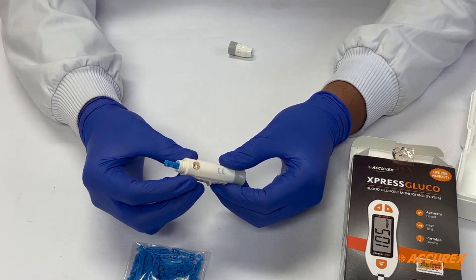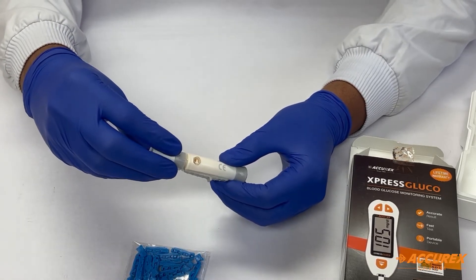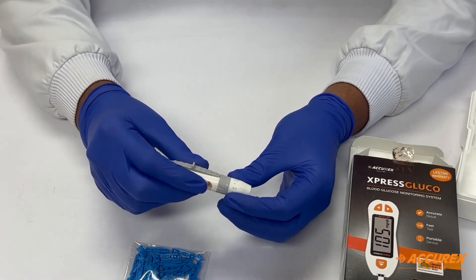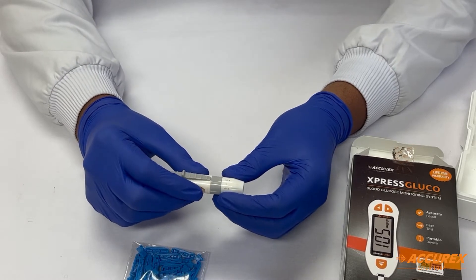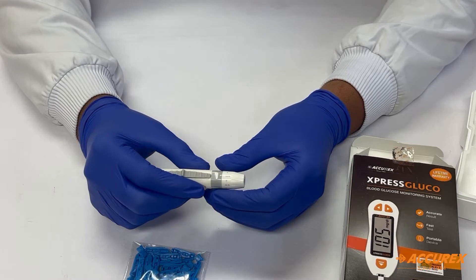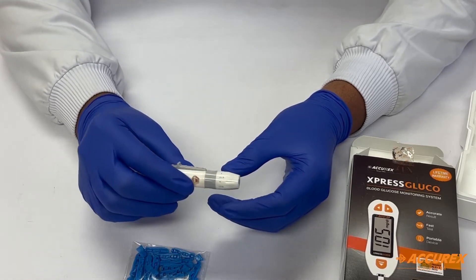After that, place the cap of the lancing device again and select the desired depth. The depth should be selected depending upon the type of your skin — if your skin is hard, the depth should be higher; if your skin is soft, the depth should be on the lower side. The recommended depth is three.